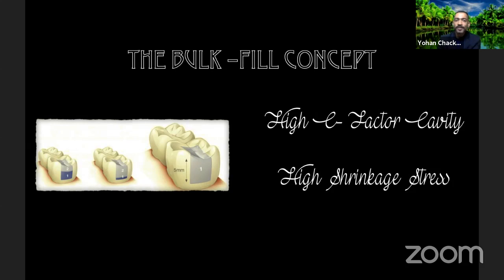It doesn't matter what composite you use. Even if you use a bulk fill composite with this kind of restoration design, it is bound for failure. Moreover, because you're going to be bulk filling at 5 millimeters or more in a box, there is an extremely high shrinkage stress that develops. And this can lead to failure, marginal leakage, sensitivity and whatnot.